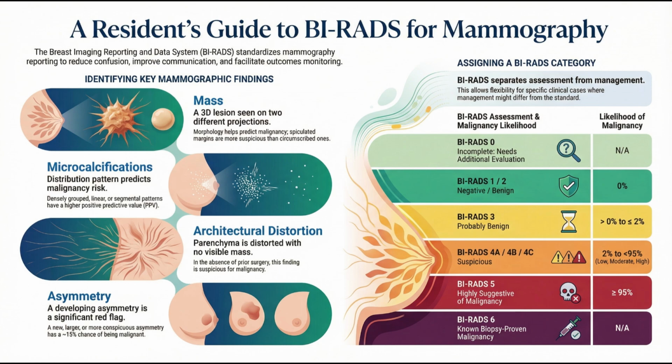So it tells the clinician how confident they can be in the reading. Exactly. How confident the radiologist can be that they haven't missed something small that's just hidden in there. That makes perfect sense. And the third mandatory piece? That's the clear description of any important findings. And this part has to include a comparison to previous exams, if you have them. Ah, the comparison. That comparison lets you tell the difference between something new and developing versus something that's been sitting there stable for 5 years. And stability is almost always a good sign.